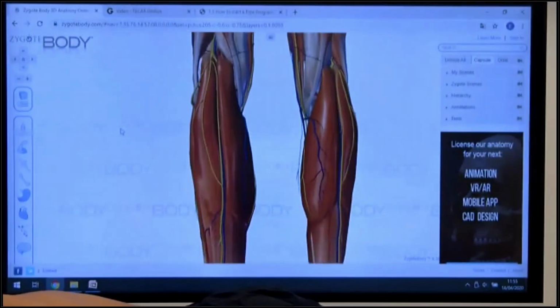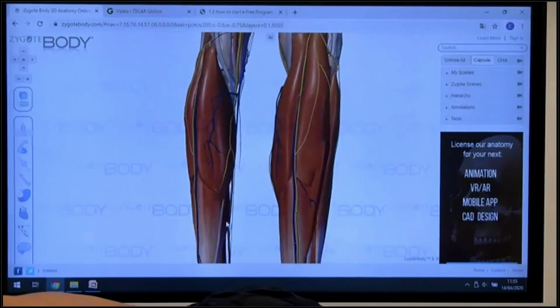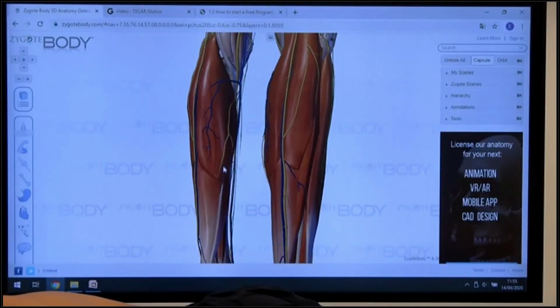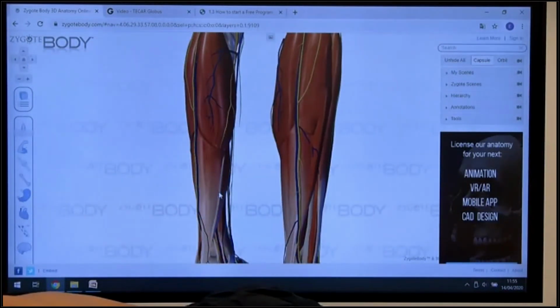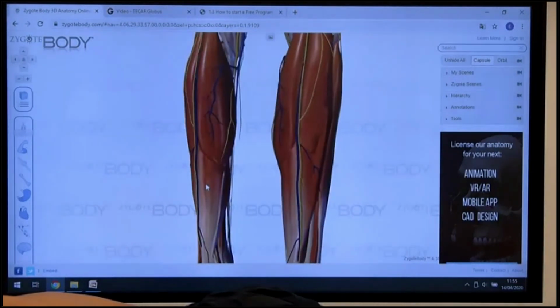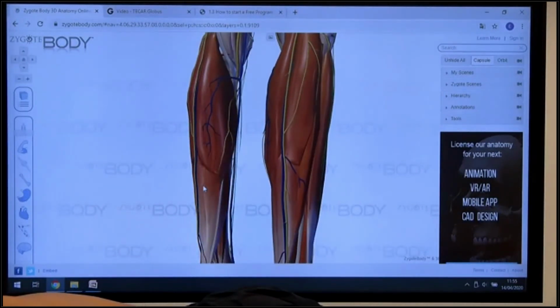So we are talking about the calf. The point is exactly this one, where there is the ending of the calf. Here there is a musculotendinous junction where the tissue starts to become more connective. As you can see, there is some white color, so the type of tissue is different.